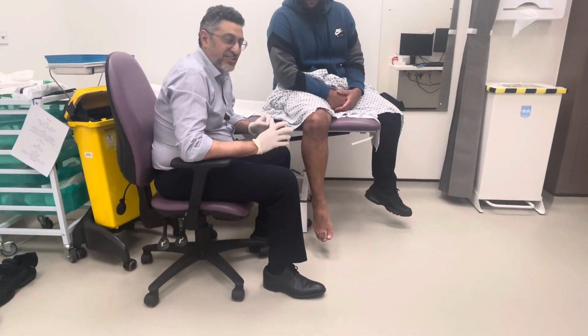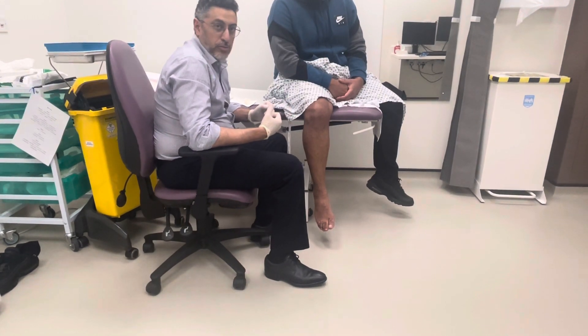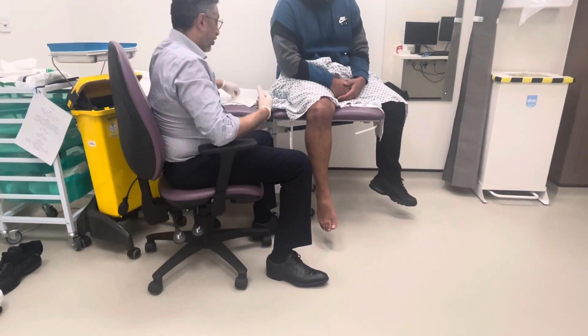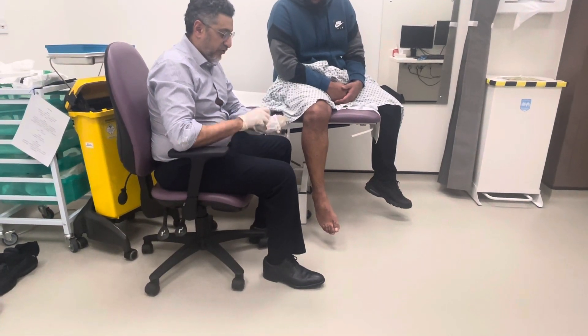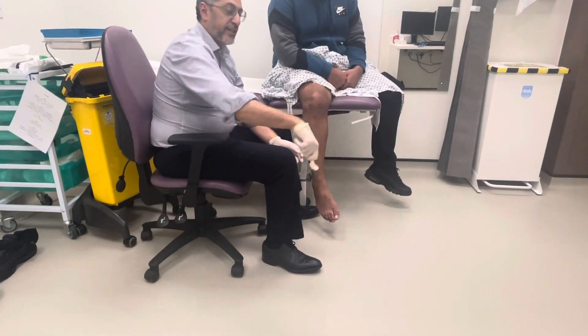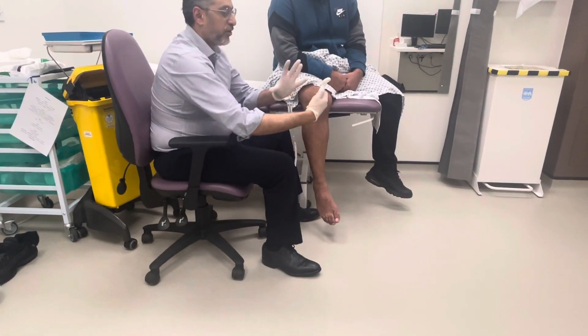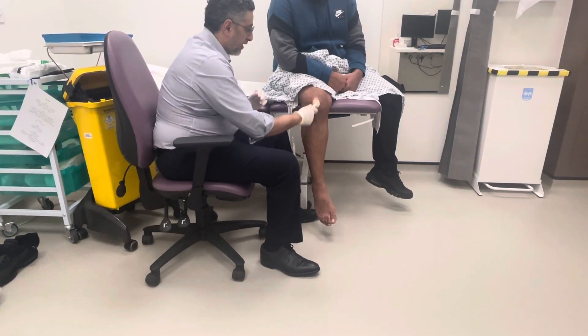Hi, a lot of patients and medical students ask me how we do a knee injection, so this is a demonstration of this. First, you have to clean around the knee — I like to do it this way because you're using gravity to open the knee joint up, so take your time cleaning around the knee.